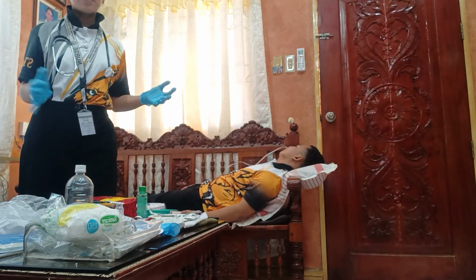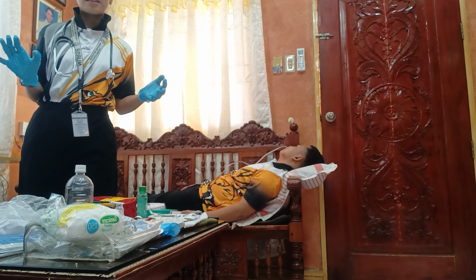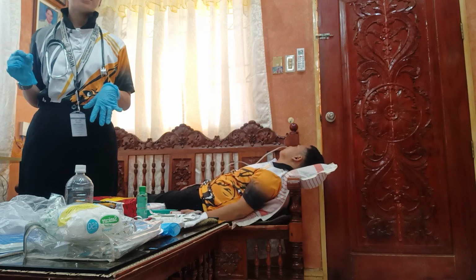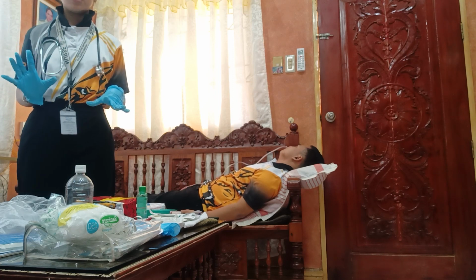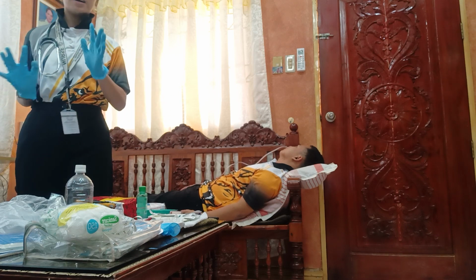So, ang rationale po nito is the X-ray is considered the most reliable method to identify the position of the NG tube. So, dito po sa X-ray na to is malalaman po if maganda po ba yung align ng NG tube at hindi po, at malaman ko po kung doon po talaga pumasok sa dapat pasukan ng NG tube at hindi po napunta sa any kind of organs like lungs.